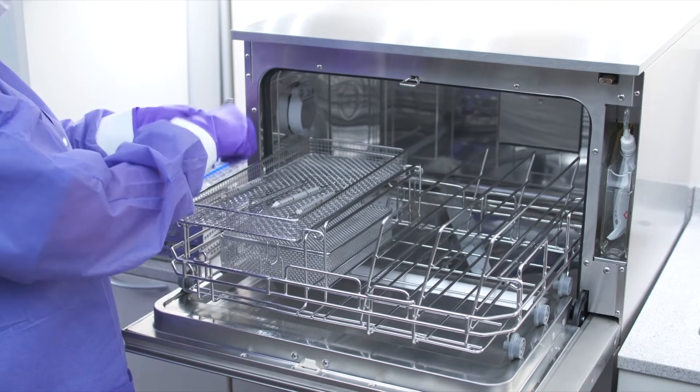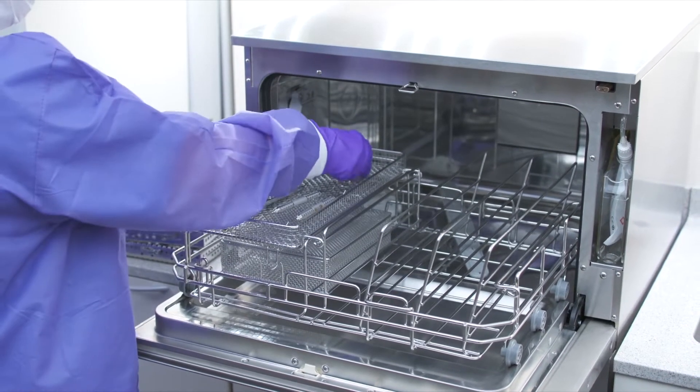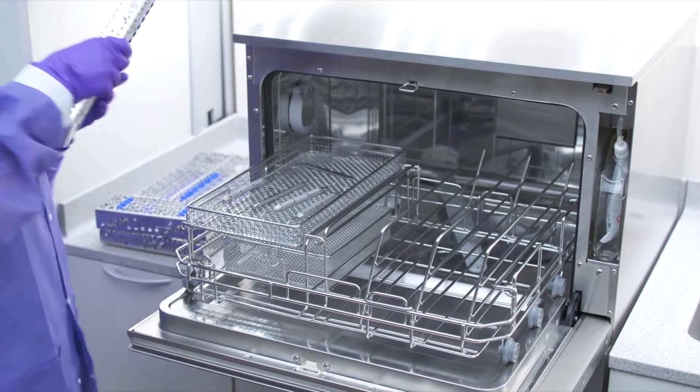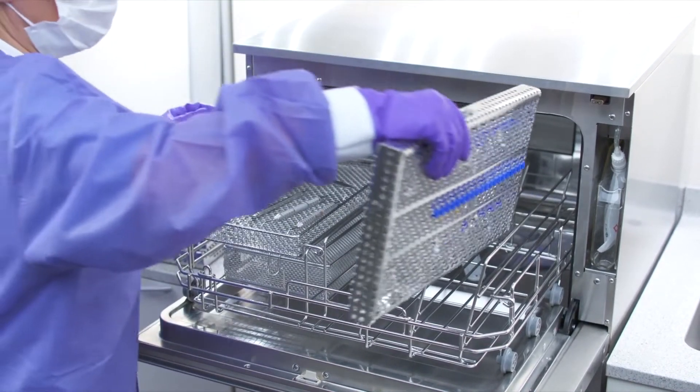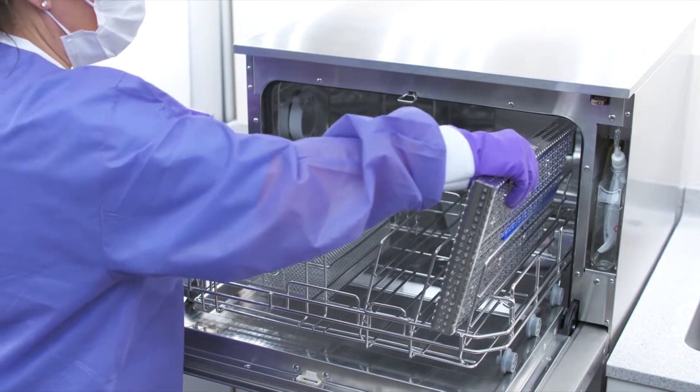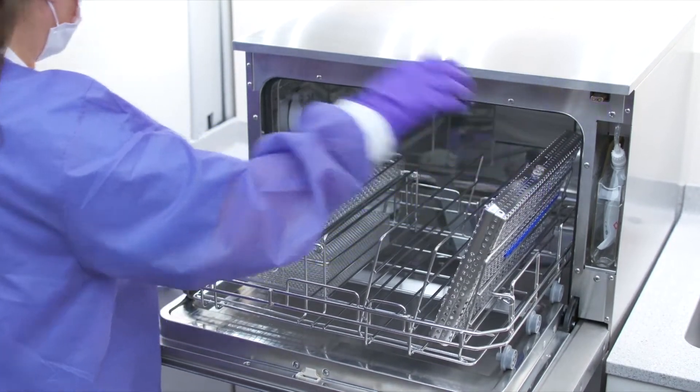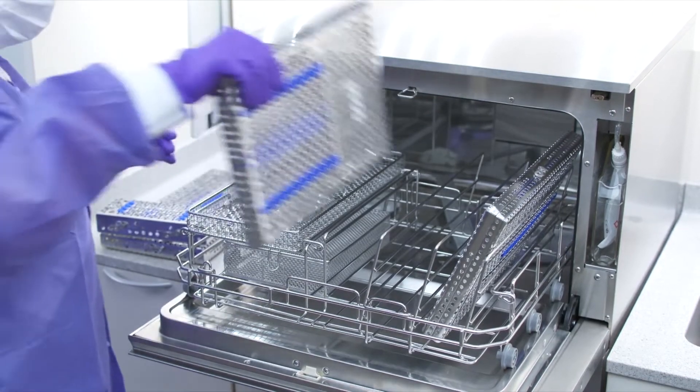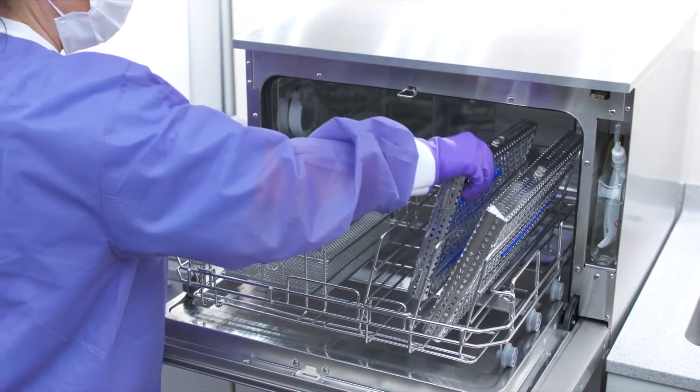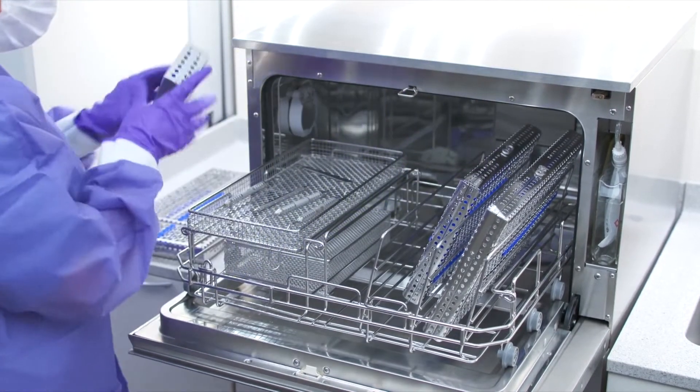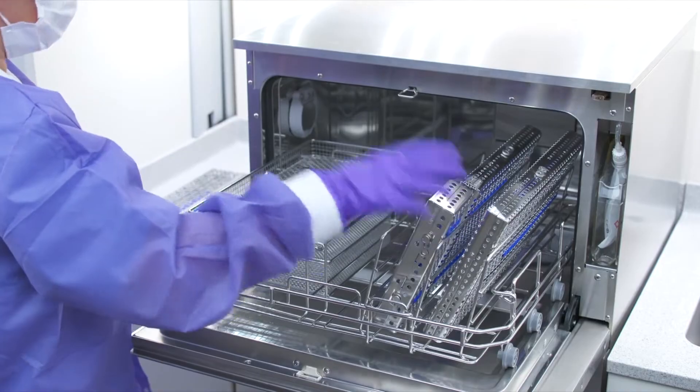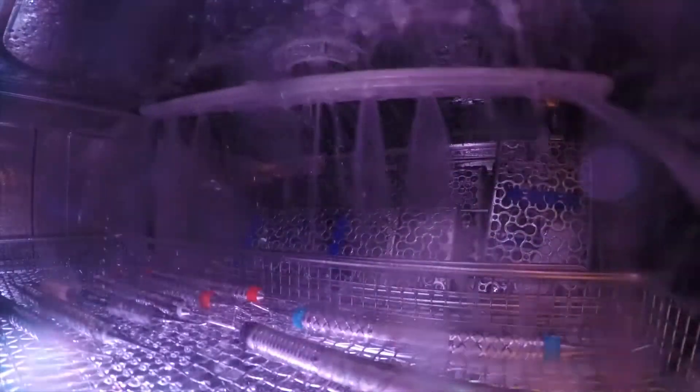The Hydrum C61wd instrument washer and disinfector is a clinical reprocessing device that minimizes physical handling of contaminated instruments, reducing the risk of sharps injury and creating a safer work environment.